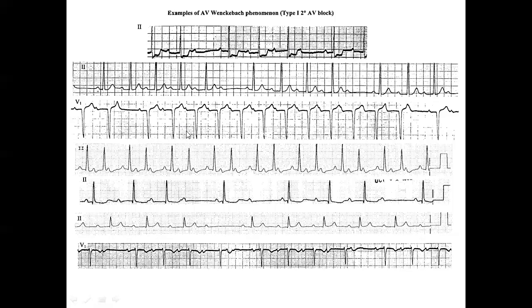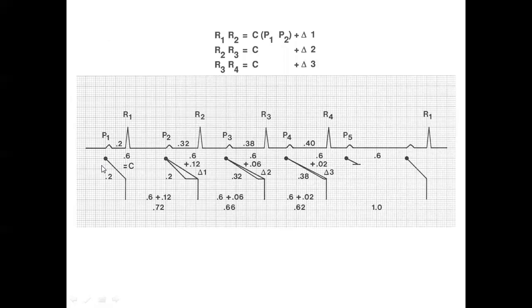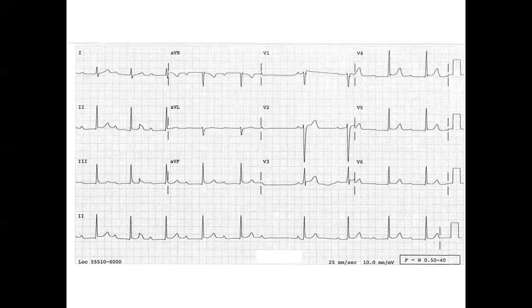Once in a while, the last one is lengthened with more increment. That's called an outlier. Many of these physiological events have an exponential curve, as you know. You have a delta here, and you have a delta here, and subsequent beats, beat 1, 2, 3, 4. So if you plot the dots, you will have an exponential curve, but at the end, there may be an outlier, so it could be longer than the previous one. So that's what we are seeing here.